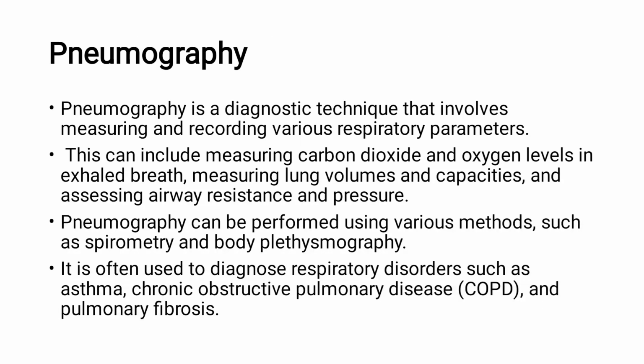Then pneumography. Pneumography is a diagnostic technique. This also involves the measuring and recording of various respiratory parameters. It includes measurement of carbon dioxide, oxygen level, then lung volume measurement, lung capacity, airway resistance and air pressure. This pneumography can be performed by various methods. These methods mainly include spirometry and body plethysmography.